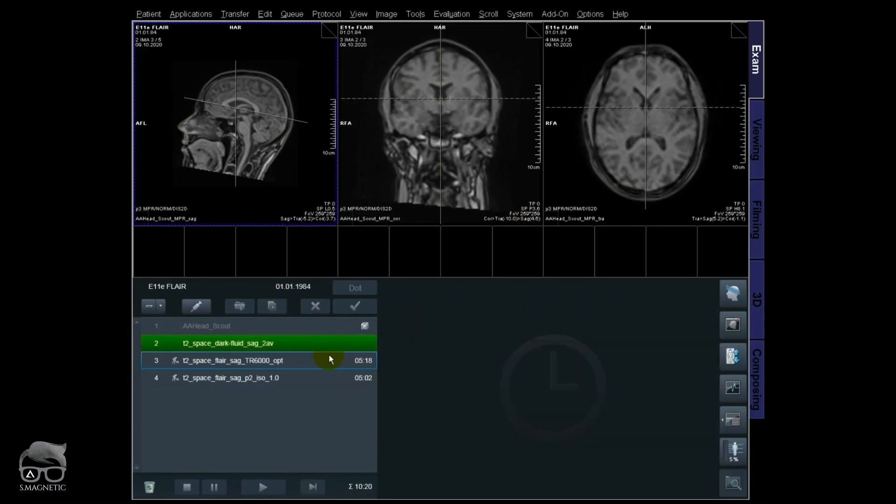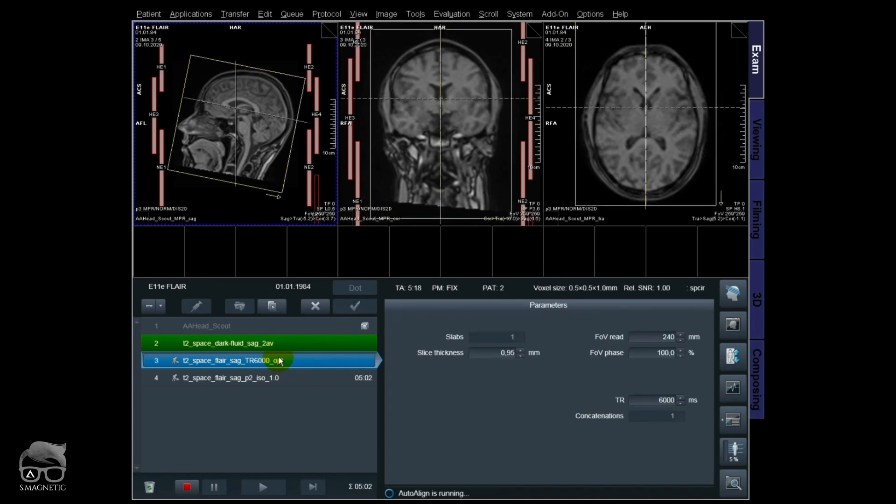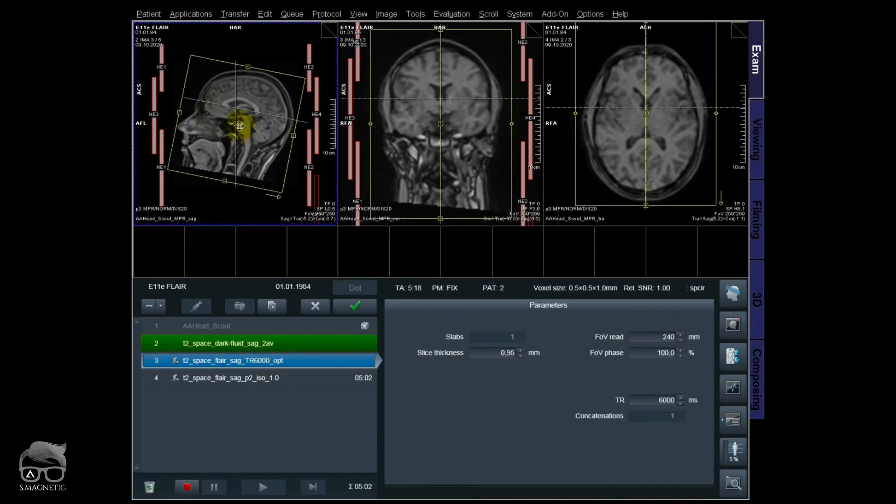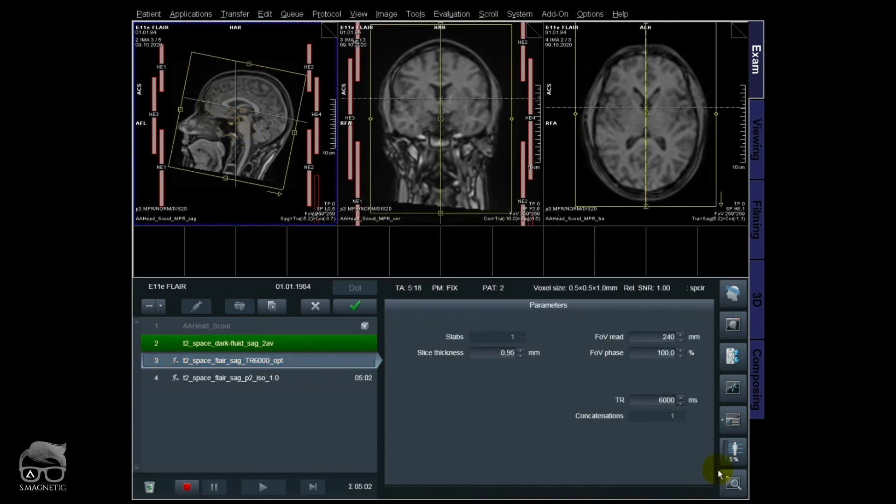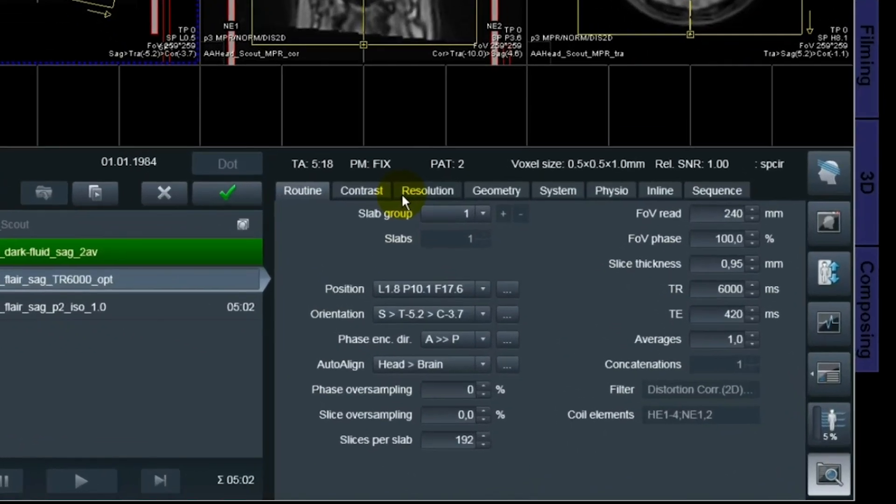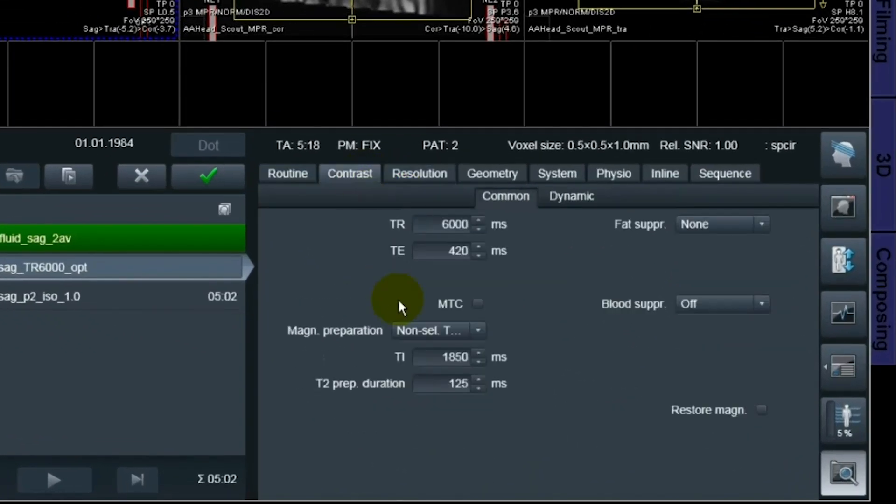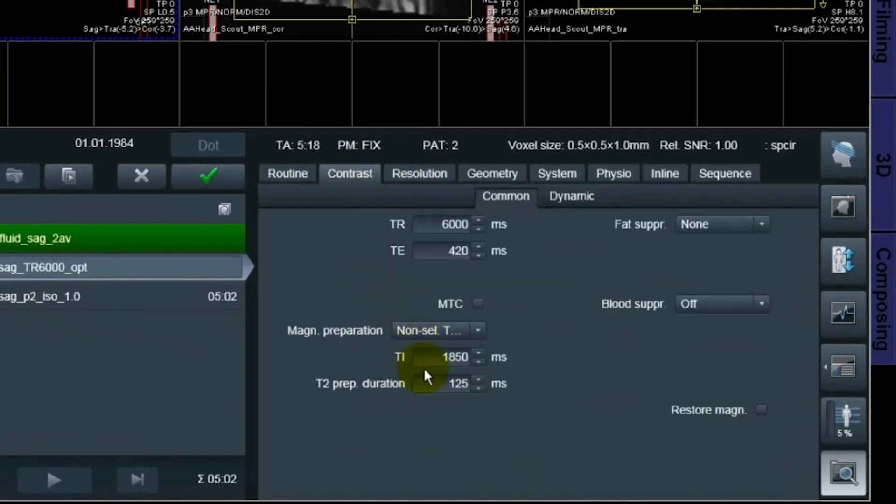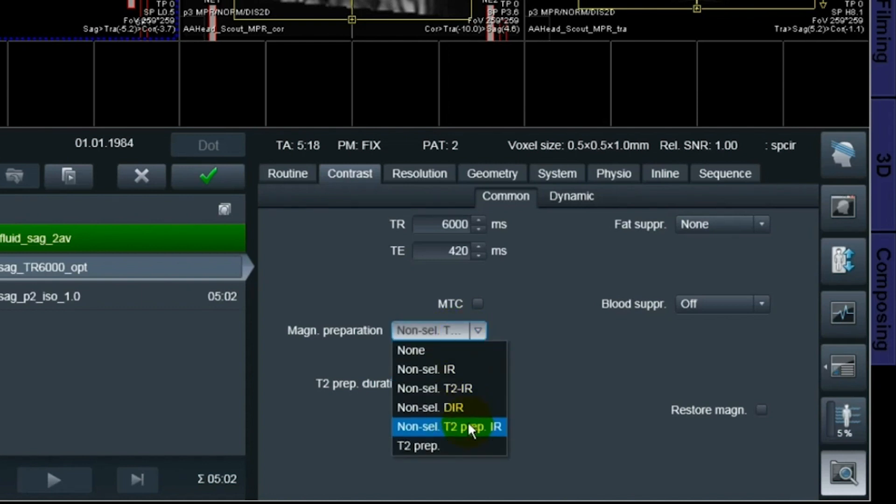Then I have an optimized sequence right here just to check if I can push it any further. With this one I also have a TR of 6000 and then the same TI time right there and the T2 prep duration by that. That also means that I'm using non-selective T2 prep inversion recovery with the new prep pulse.